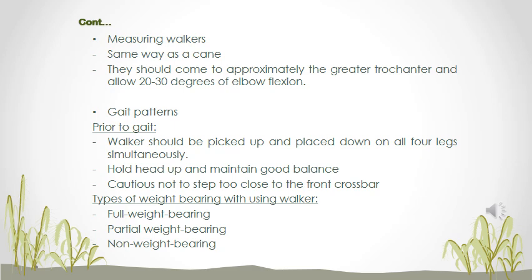Prior to gait, the walker should be picked up and placed down on all 4 legs simultaneously, not the back legs and then the front legs. Instruct your patient to hold their head up, maintain a good balance, and caution not to step too close to the front of the crossbar of the walker, because then they can lose balance.